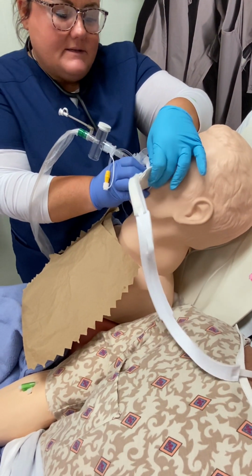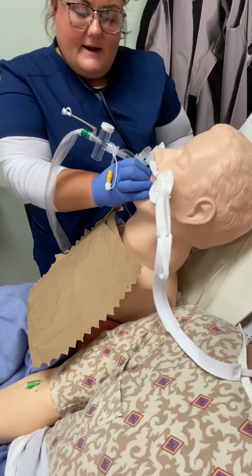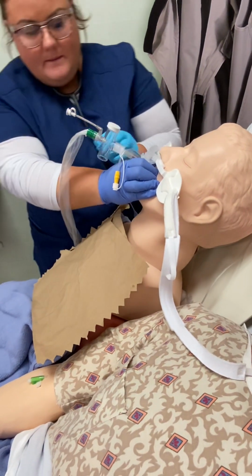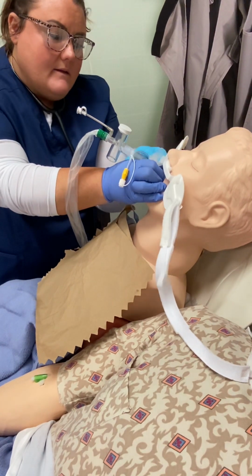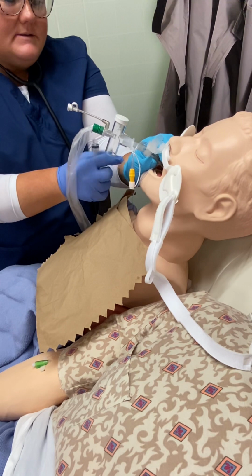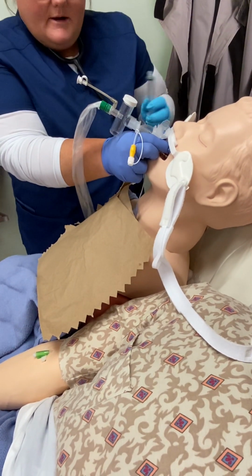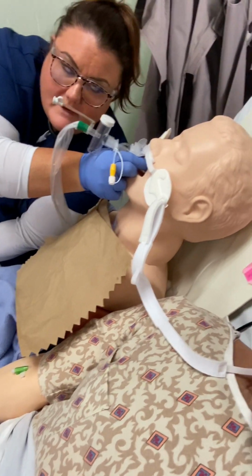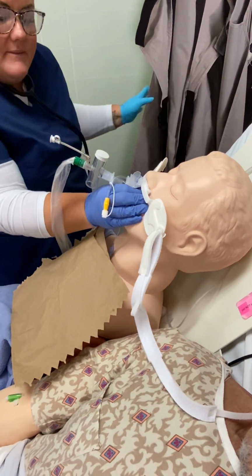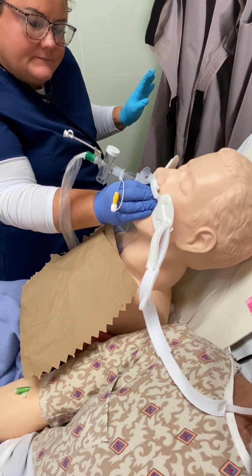All right, just keep taking those nice breaths for me. All right, let me grab this tube over here. All right, well actually, you know what? We'll wait on that. Okay, so now what I'm gonna do, have you take that nice breath for me, okay?